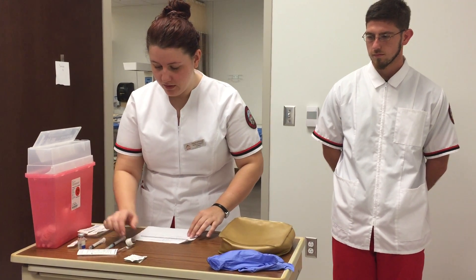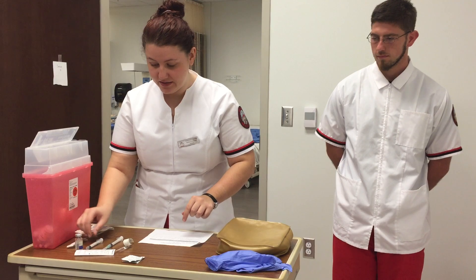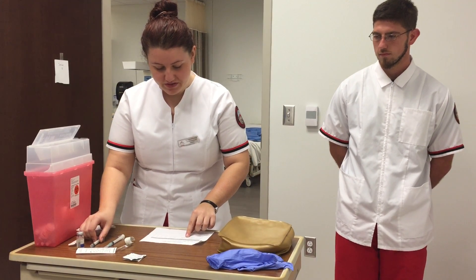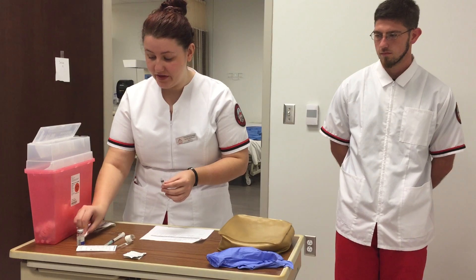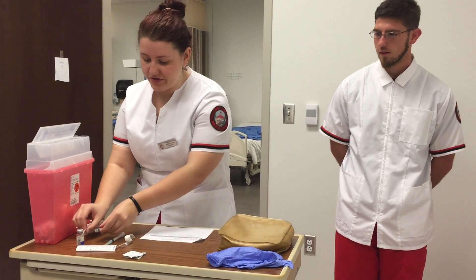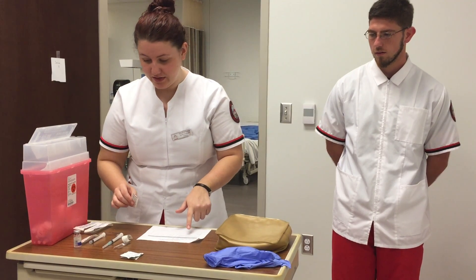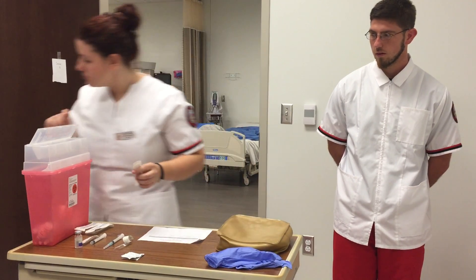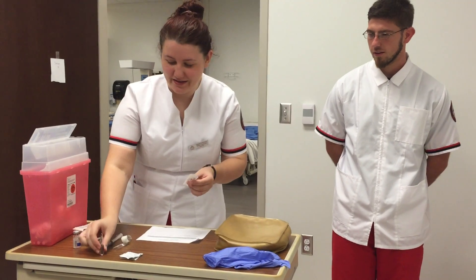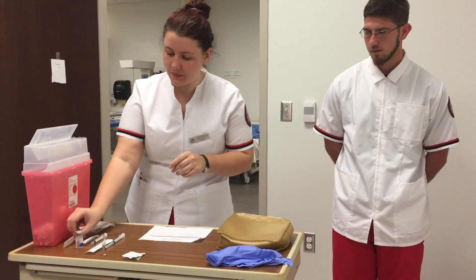For my subcutaneous injection, I have 0.5 milliliters of solution and I need a 25 to 27 gauge needle. I have my syringe ready as well. I'll be using an ampule for this one and I have a filter straw for it, but I'll get that all set up in a moment.